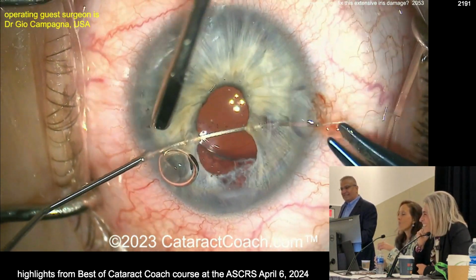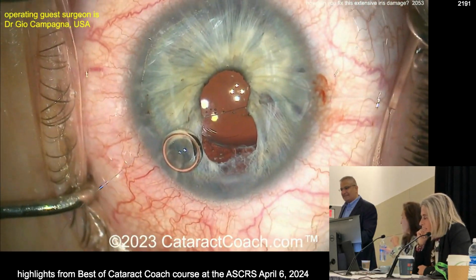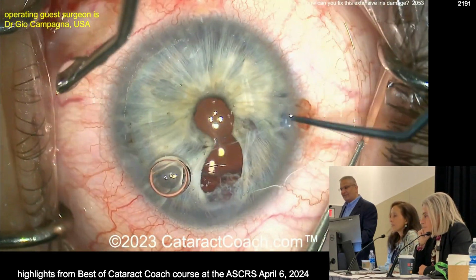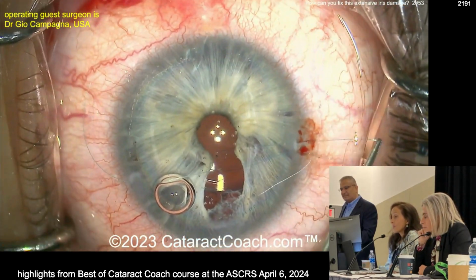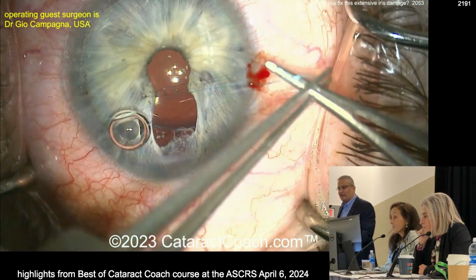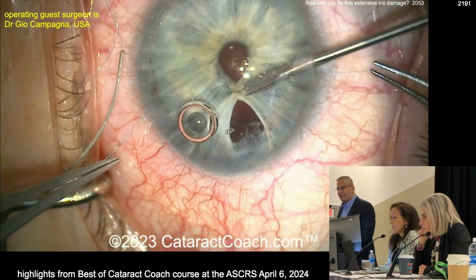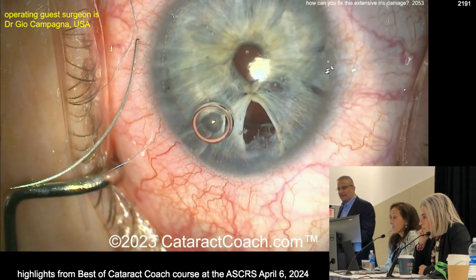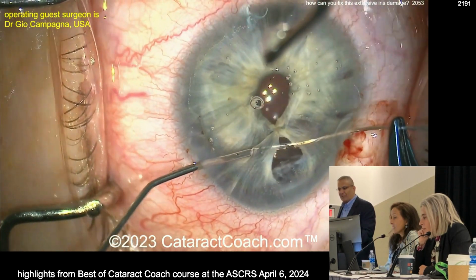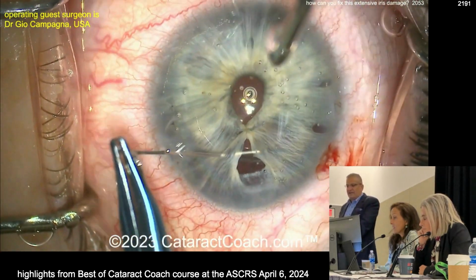So here we go. We got our guest surgeon here doing a good job, doing a little pupiloplasty here. And the key on this one too is just making it match the other eye, having it look reasonable from conversation distance. Now this iris is super thin, and that's the problem. You can cheese wire through it pretty easily. So you really got to be a little easy. And look, as he's tightening this up, it's creating what looks like peripheral iridotomies there, and that's because the iris is that wimpy.